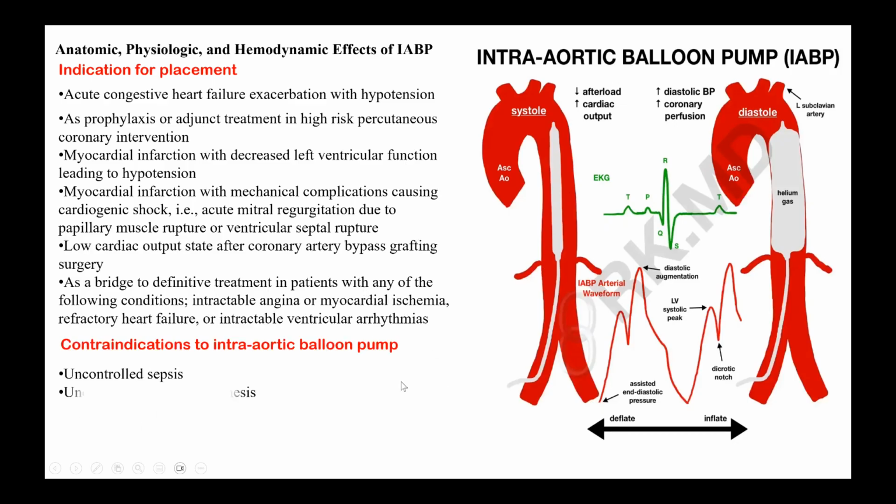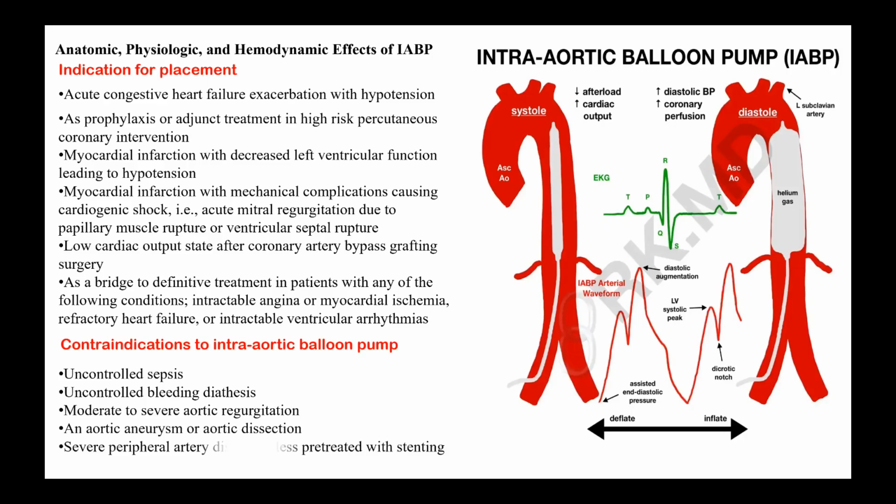Contraindications are uncontrolled sepsis, uncontrolled bleeding, moderate to severe AR, aortic aneurysm or aortic dissection, severe peripheral vascular disease, especially in iliac grafting, suprainguinal vascular disease, where that has been repaired with a graft and all those conditions. You should not use this.